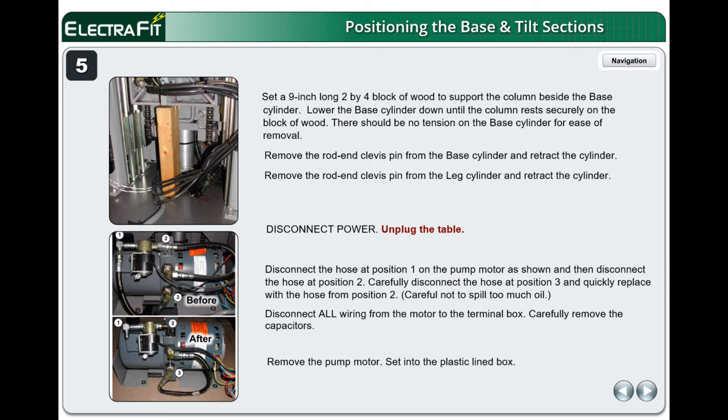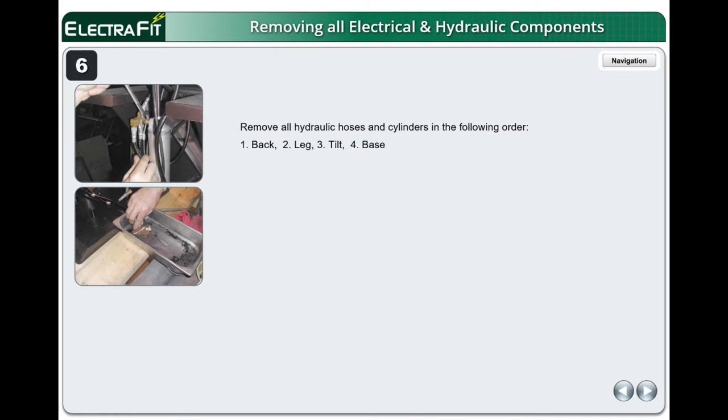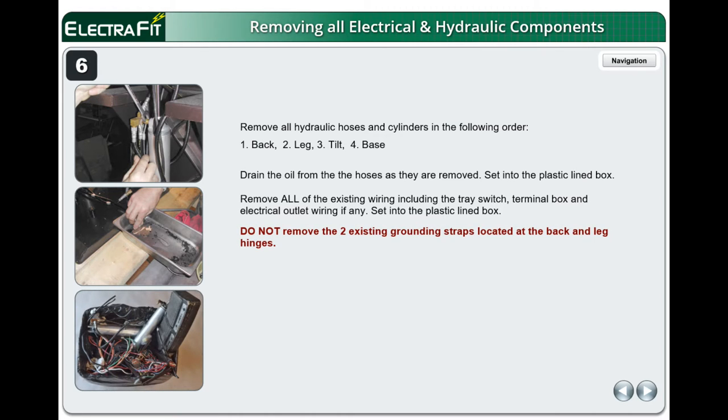Set the pump motor into the plastic-lined box. Remove all hydraulic hoses and cylinders in the following order: 1 back, 2 leg, 3 tilt, 4 base. Drain the oil from the hoses as they are removed and set into the plastic-lined box. Remove all existing wiring including the tray switch, terminal box, and electrical outlet wiring if any. Set into the plastic-lined box. Do not remove the two existing grounding straps located at the back and leg hinges.